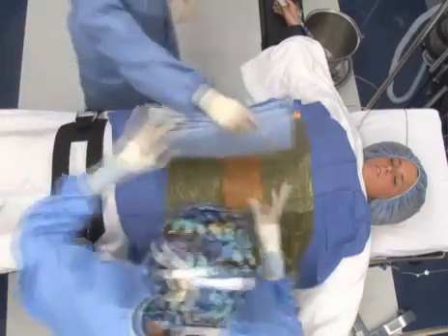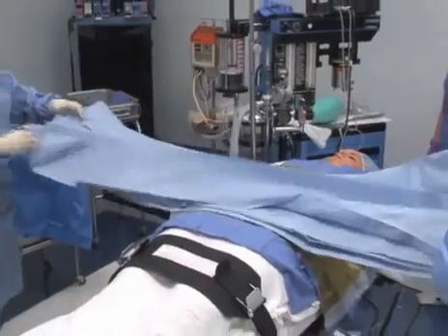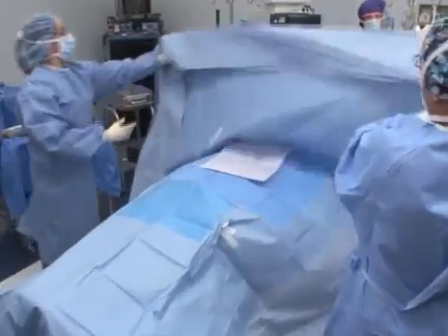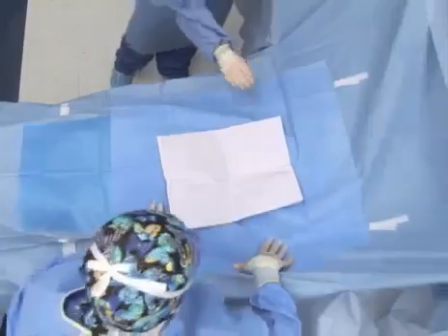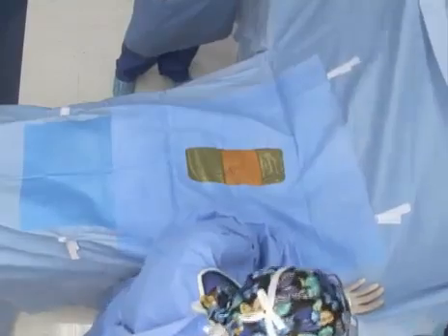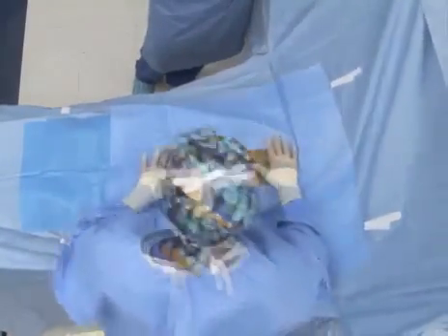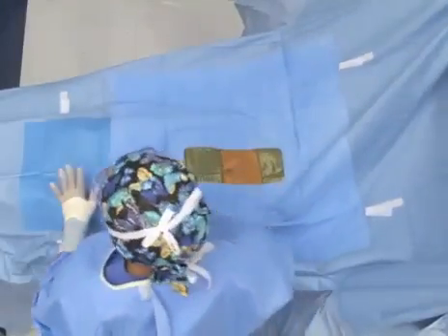The last drape to be applied is the top drape, also called a procedure drape or specialty drape. The specialty drapes are fan-folded and compact. The folded drape must be positioned over the surgical site correctly before it is unfolded. It cannot be shifted once it is positioned, so it must be correct the first time. The fenestration is centered over the incision site and the drape unfolded over the patient's body.